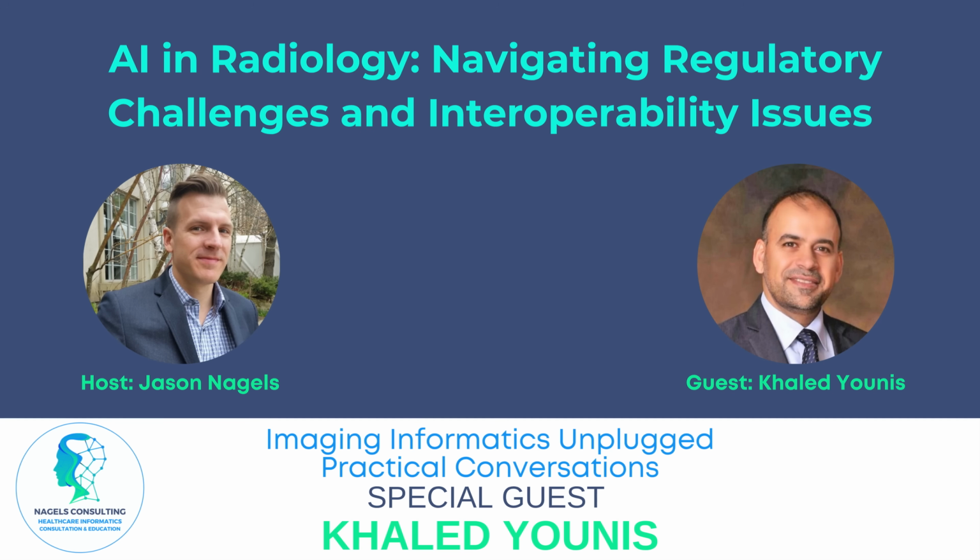So that's one way to look at it. But there are, of course, some changes. The FDA is also working on the PCCP, the Predetermined Change Control Plan. That is for the AI models that I described earlier. They have been working on that for a very long time.